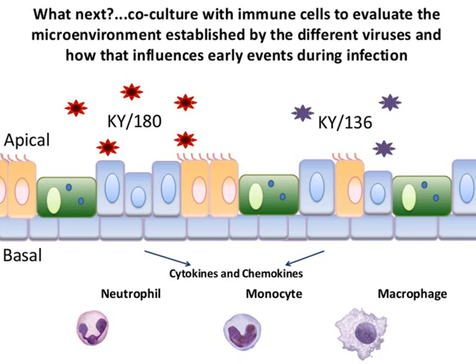This co-culture would further demonstrate how microenvironment established by EpiAirway cells could influence pathogenesis.